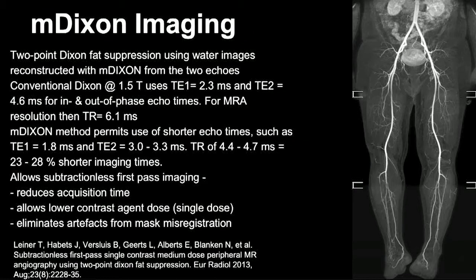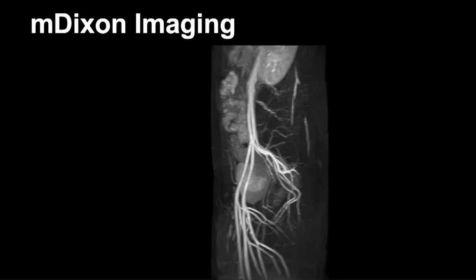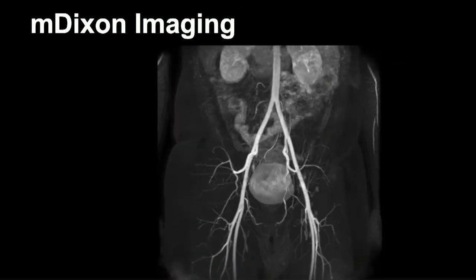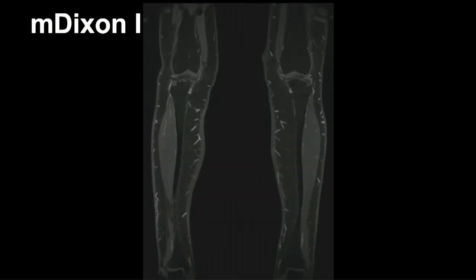Well, if you skip your mask section and you can reduce your angiogram time, the patient's on the table for less time. They're more comfortable and they will be able to stay still. You'll get a better quality angiogram, and you'll be able to give more information to your surgeons and interventional radiologists to try and keep that leg attached and healthy for longer.